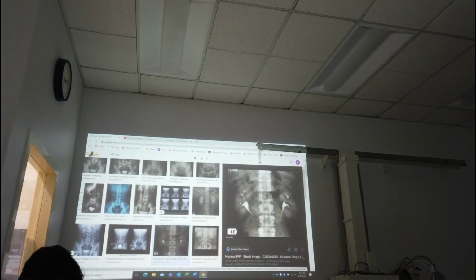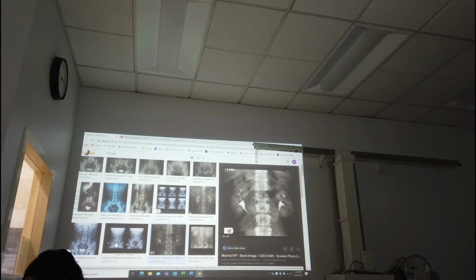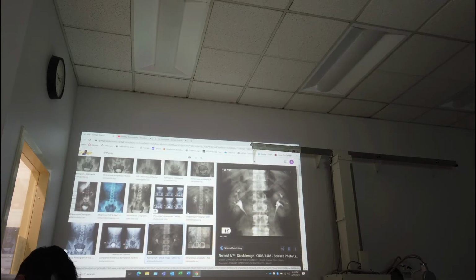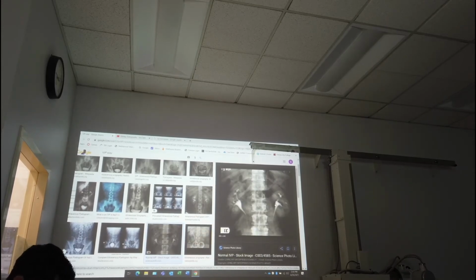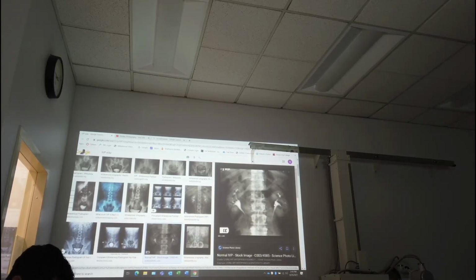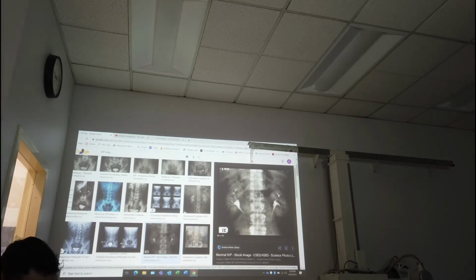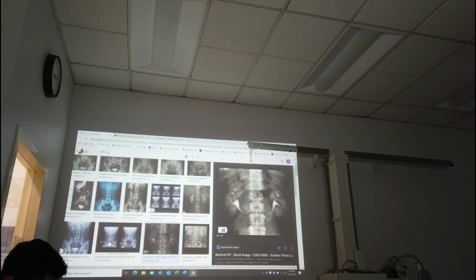And when you push a large amount in fast, the kidneys are going to take it in and highlight really quick. And you're going to see the renal pelvis fill up really fast. So everything just happens in large amounts. But if you're dripping it, it's going to be really slow. The kidneys are slowly taking it in and slowly getting rid of it, and the renal pelvis really doesn't fill up like it should. So dripping sometimes is no bueno.